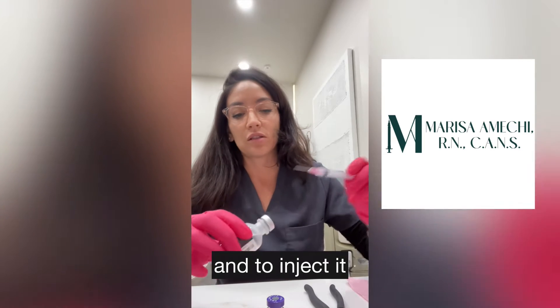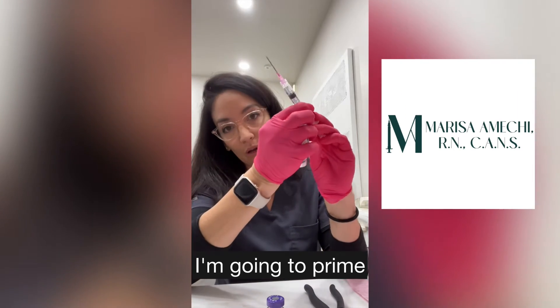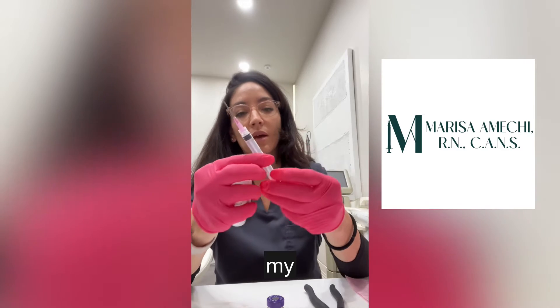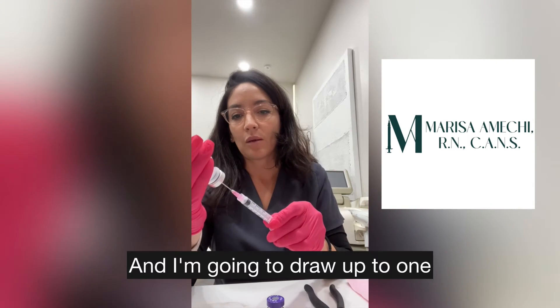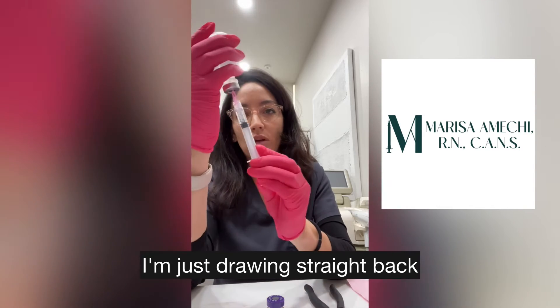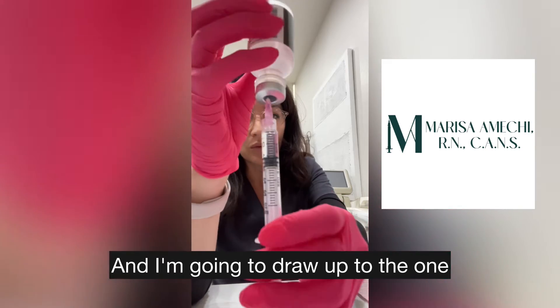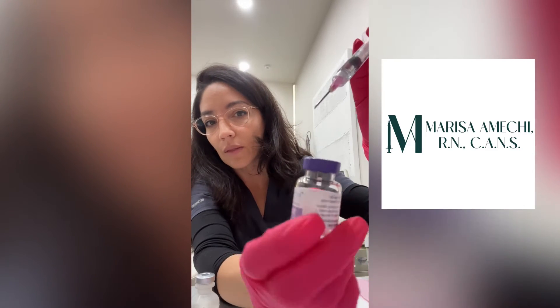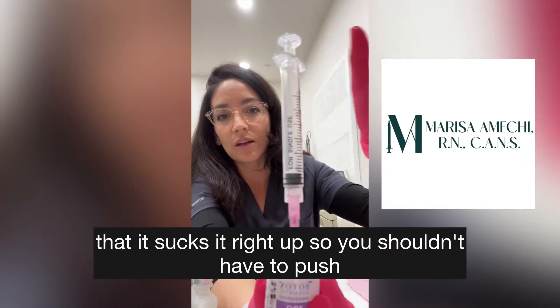Then I'm going to prime my syringe — sometimes it gets stuck. I'm going to draw up to the one without injecting air, just drawing straight back to the one. Then I'm going to put it into the Botox vial and you should notice that it sucks it right up — you shouldn't have to push.